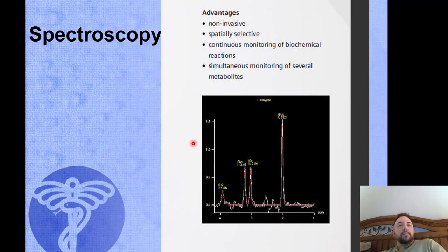So, why is it important to even know that there is a chemical shift? There's an awesome technique at our disposal called MR spectroscopy. Take a look at this MR spectroscopy. Agreed, this is a little bit of an older slide image, but it gets the point across. You're not looking at isointensities. You're not looking at bright or dark signal intensities, what's hyper, hypo intense, bright fluid, dark fat. You're not looking at any of that.